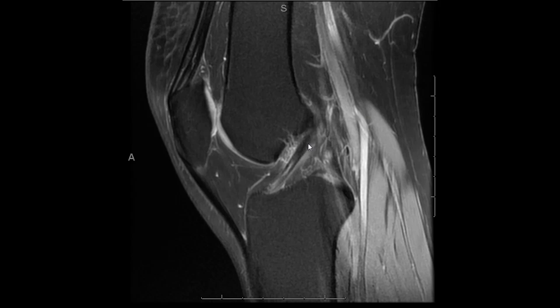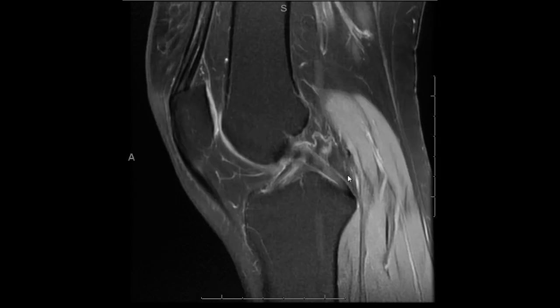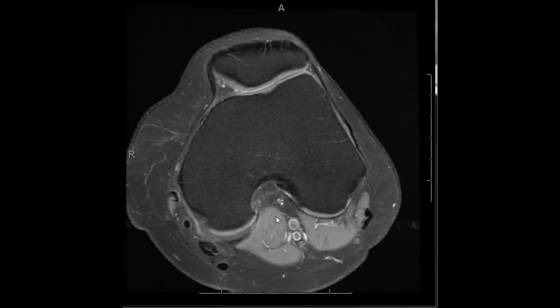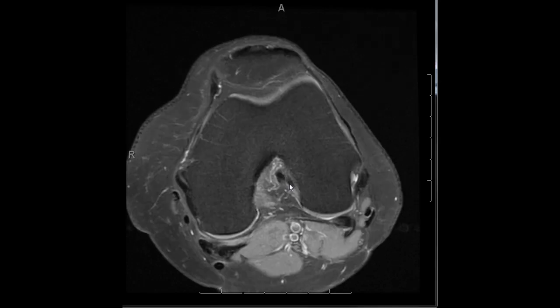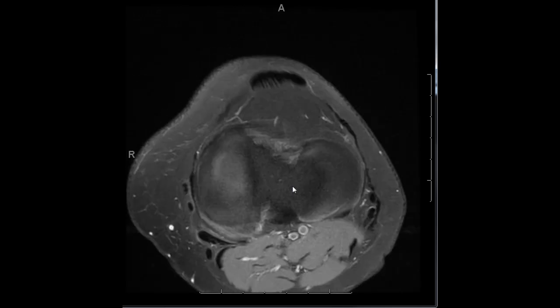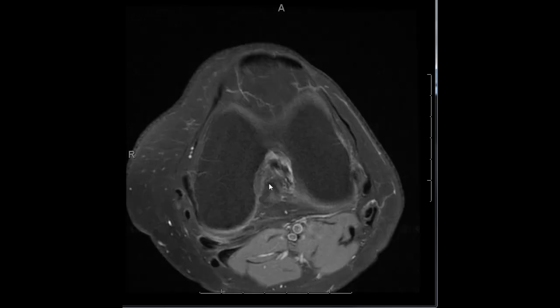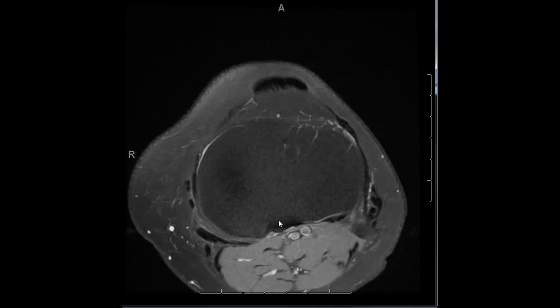The anterior cruciate ligament is seen here. It has a relatively taut course and it parallels Blumensaat's line, which is the roof of the femoral notch. The PCL is also seen on the sagittal image. On the axial sequence, the ACL is seen going from bone on the lateral femoral condyle, extending caudally into anteromedial and posterolateral bands to insert on the tibia. The posterior cruciate ligament is somewhat less well seen on axial images, but is seen here on the medial femoral condyle extending caudally.